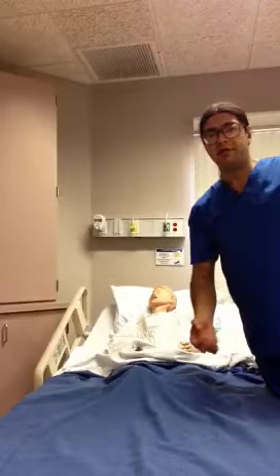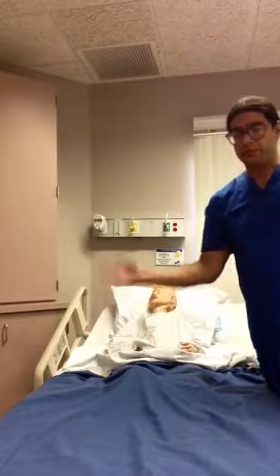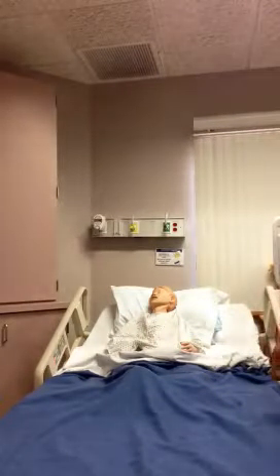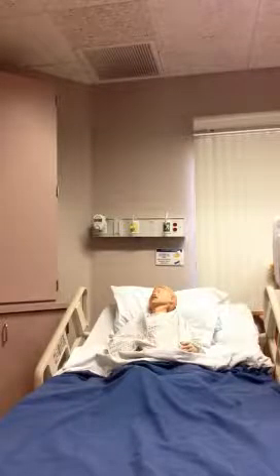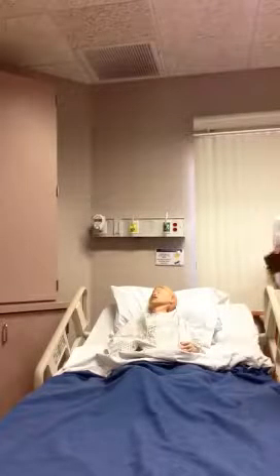Hello, I am here to do my blood glucose check and insulin administration video. I will begin by knocking before entering the patient's room. I enter the patient's room after doing hand hygiene. Do hand hygiene on the way in.